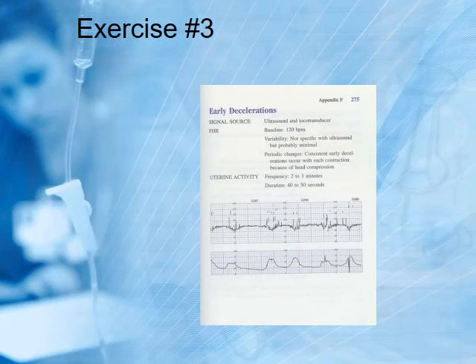And the final one, early decelerations. You see them happening right above, the nadir is above the peak. They're round and smooth, so those are earlies. Yeah, would you have recognized that? This one over here looks a little more variable because it goes down kind of fast. So you could have a combination of them. I'm not just making that up. Because if she's pushing and also the cord is there, you're going to get 2 types of deceleration.